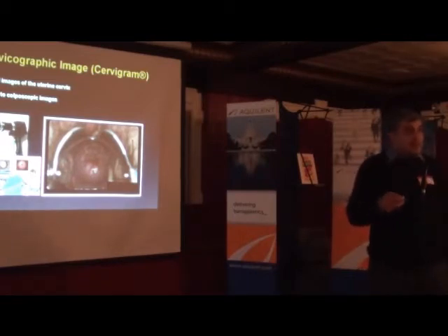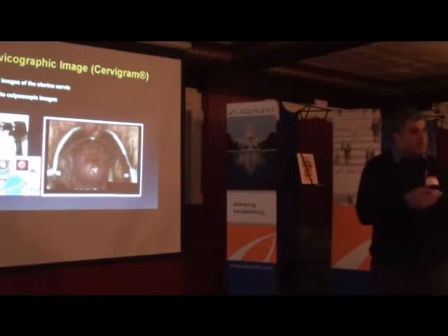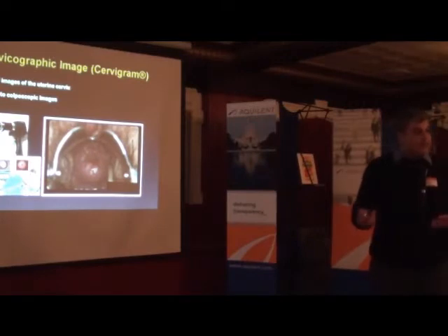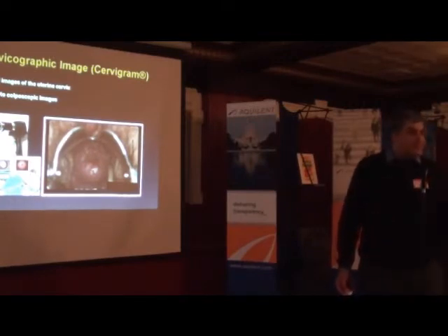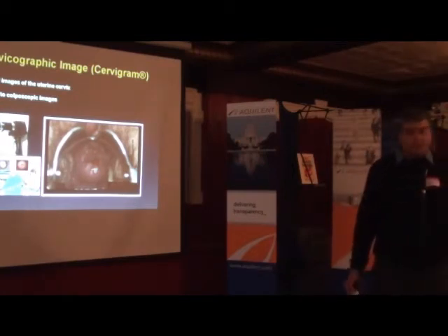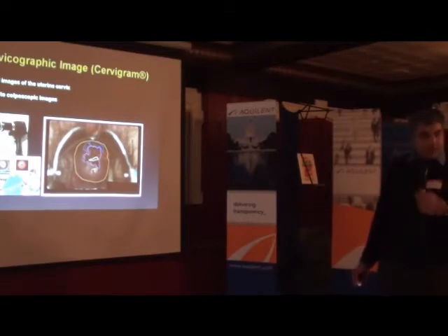Now, it's a different thing that you've got to go through another study to figure out what type it is and will it lead to cancer. But they were trying to map visual appearance to the potential for cancer. And so we built a tool to find images that look alike, that have the same lesion, the same degradation of the lesion and so on, with the hope that it'll be useful in the field. And that's the lesions that have been marked by an expert.